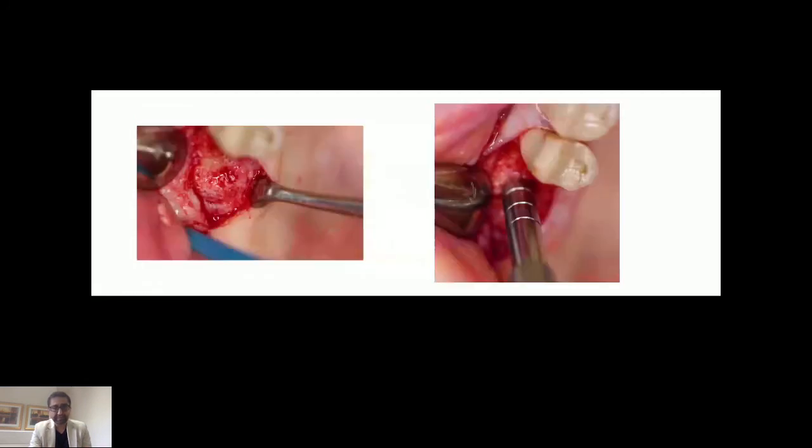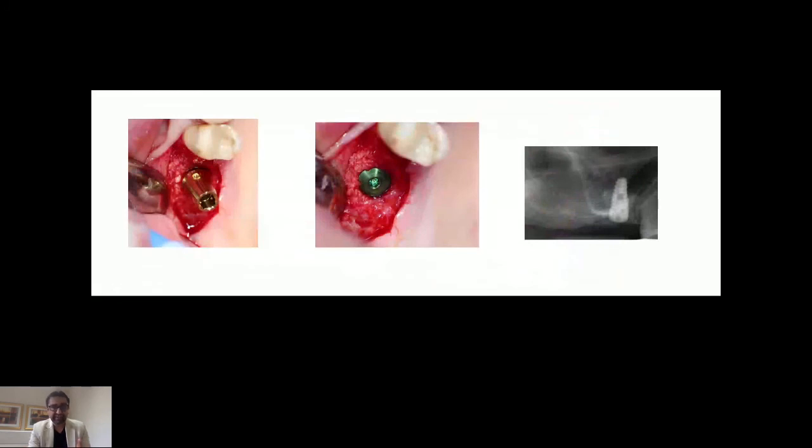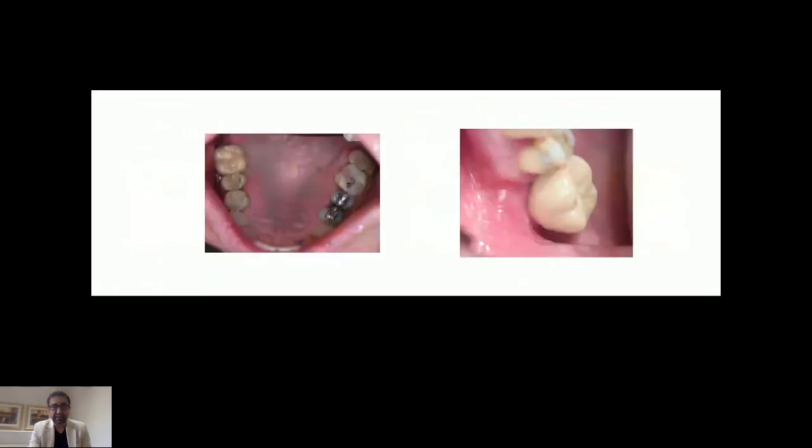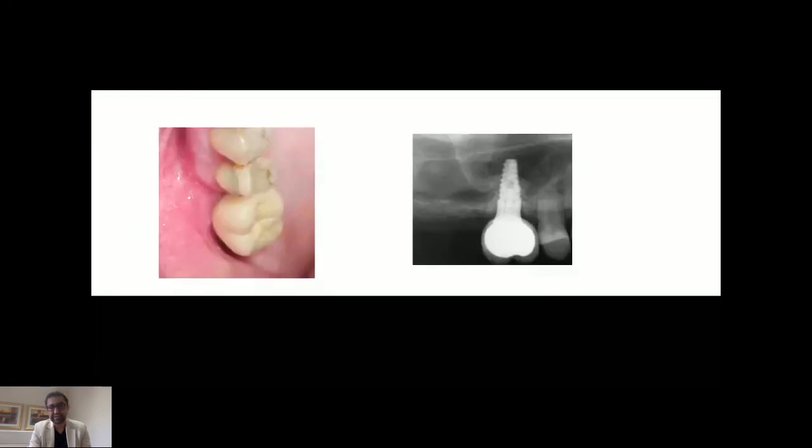Again, osteotomy. I'm a lover of osteotomes, although the problem with osteotomes is that it can cause discomfort to the patient, but there are magnetic osteotomes or mallets available as well now. So with osteotomes, place the implant in, and you can see with the implant, we've done the crestal approach and placed the implant in. So extraction, grafting, crestal approach, and look at the soft tissue healing. Keratinized mucosa all around, nice abutment in there, and that's the final picture and the X-ray. You can see nice bone developing around your implant, and that's your implant in.